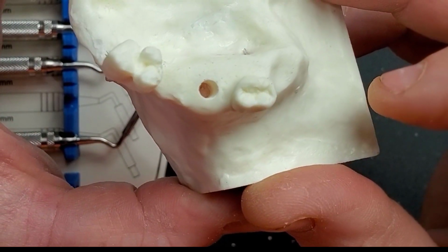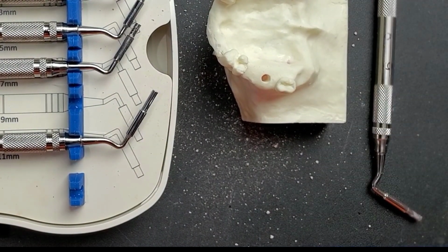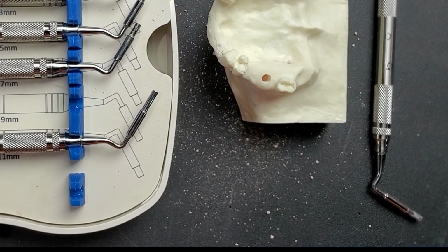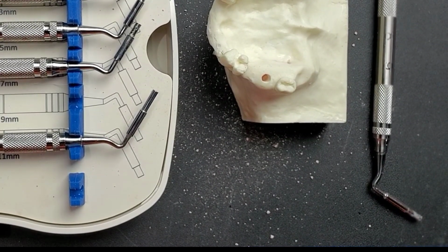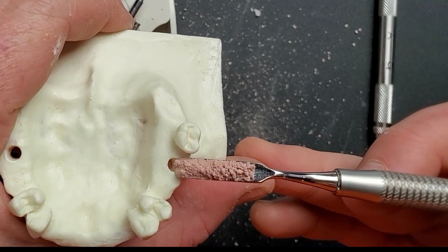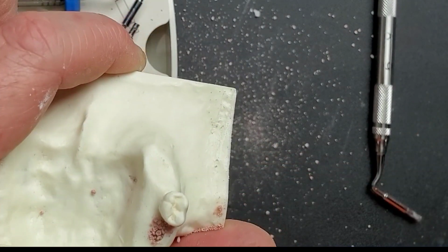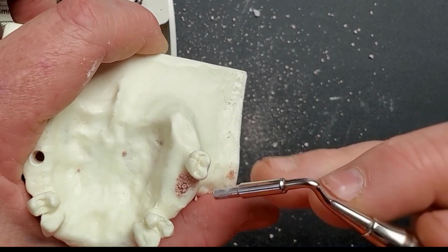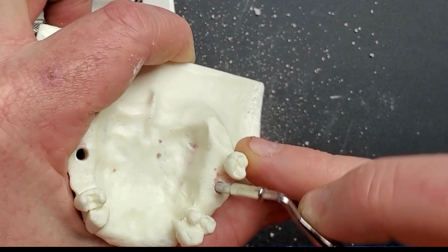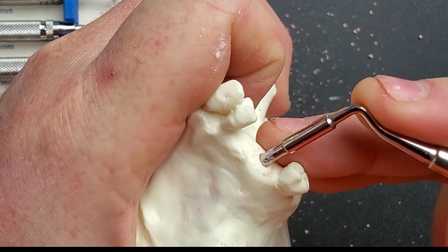All right. Now, I should say that when you're doing a sinus lift on a crestal approach, you can't really know how much bone volume you're going to need ahead of time. That's because every sinus is shaped a little bit differently. If it's a big, wide sinus, then you might need a lot more bone to get 2mm or 3mm worth of lift than you would if you were doing this in a really skinny sinus. Okay, so the only way you can tell is to periodically stop and take a PA and verify how much of a lift you have at this point.